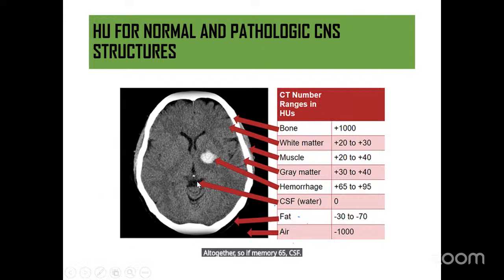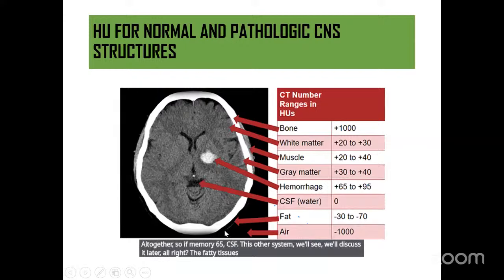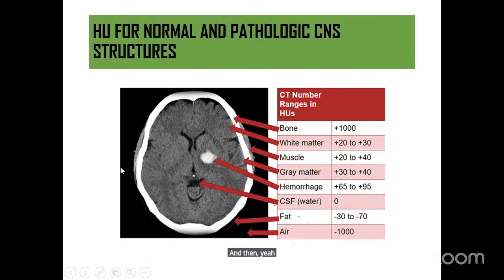CSF, this is another system we'll discuss later. All right, the fatty tissues, look at the fatty outline, that's the subcutaneous tissue, and then outside here, they are all air.